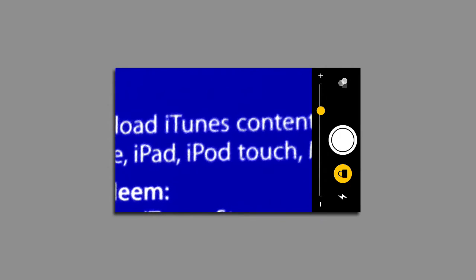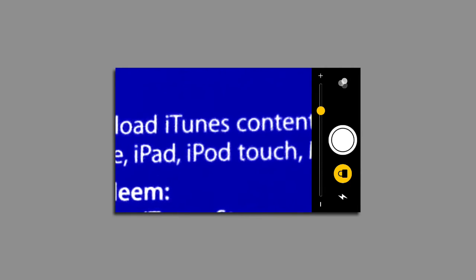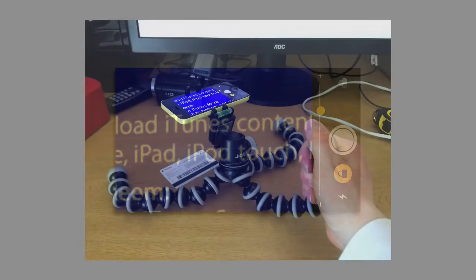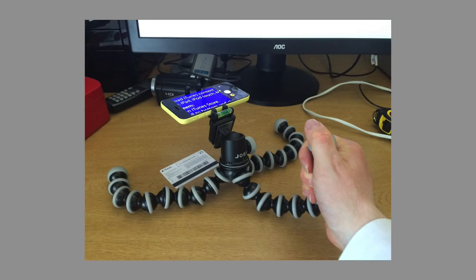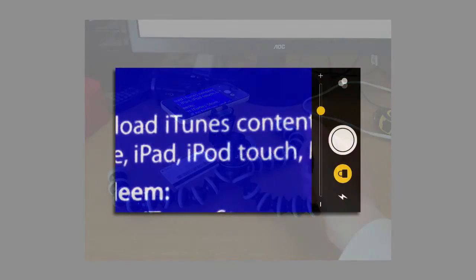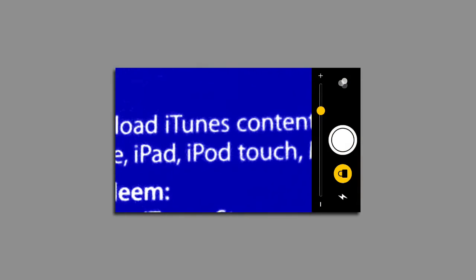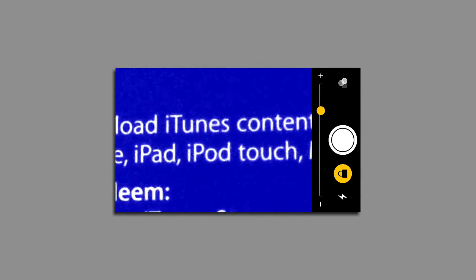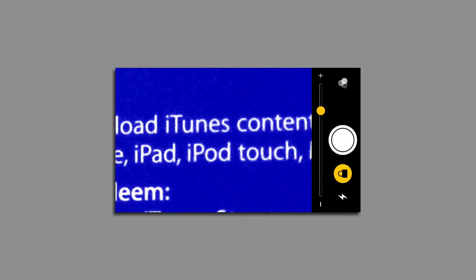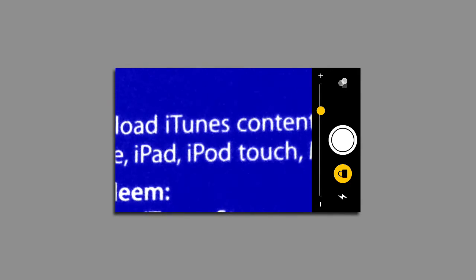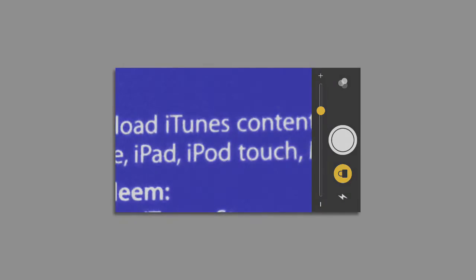As I've shown earlier, I'm actually using a Joby GorillaPod which makes quite a good stand for the magnifier application. It's unlikely that this would replace a dedicated hardware magnifier, but certainly if you only need to use a magnifier occasionally, it's an option worth looking at.